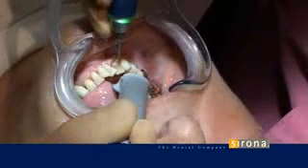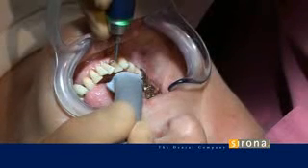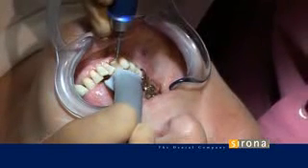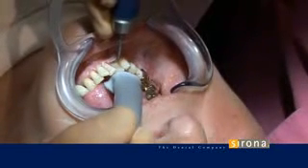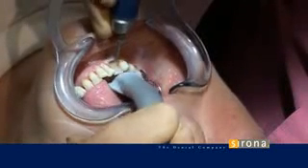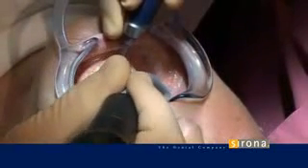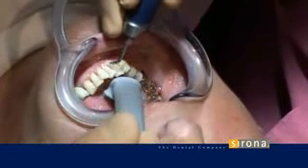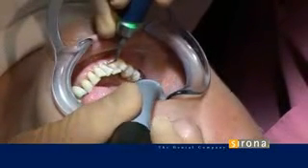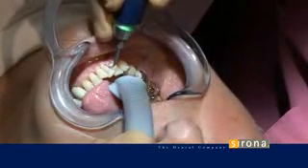The pocket is probed a second time to check the treatment results. Perioscan shows mainly green. However, individual areas must be treated again. Now the root surface seems to be clean, and the treatment continues in the mesial region.